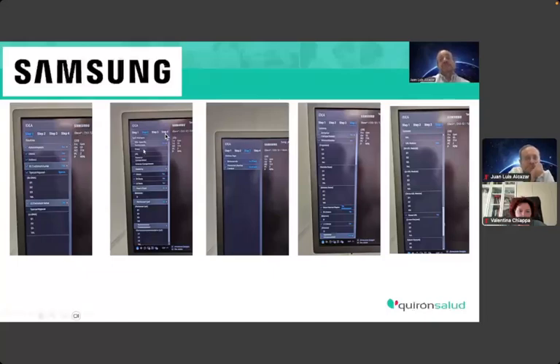Where is the painful point? Is it affecting the ovary, the uterosacral ligament, or either the anterior or posterior compartment? Then you have to look for the mobility of the ovaries, if it is mobile or not, and if it is mobile in relationship to the uterus or to the pelvic side wall.